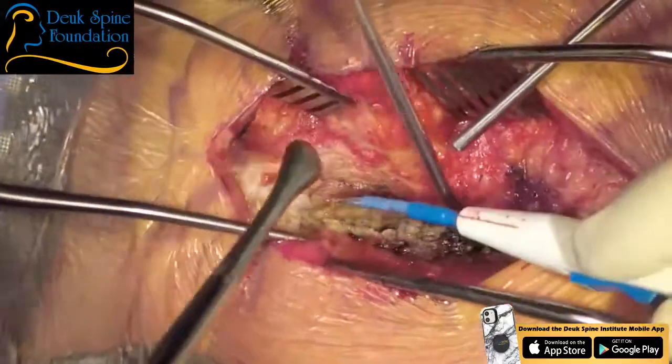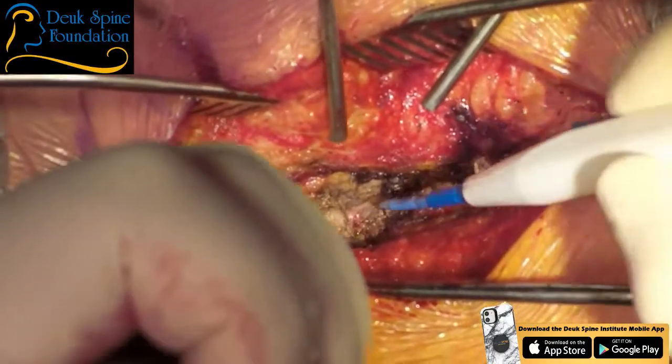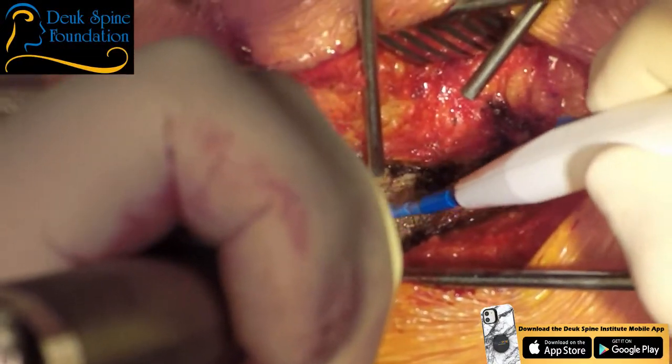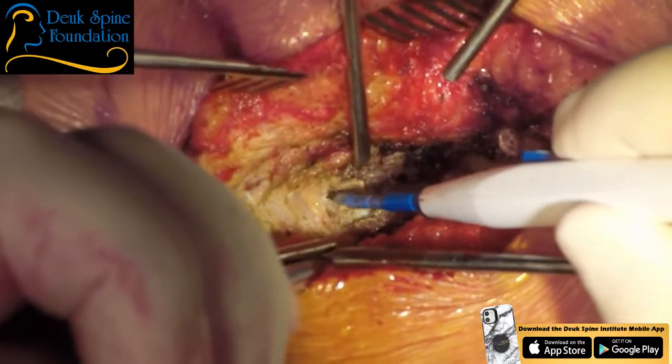Another thing you need to know when you're doing the exposure is you want to be between the muscle bellies. So that's why you want to come down on the tips of the spinous process as well. You don't want to come into the muscles. You want to come in between the muscles. And as long as you come down on the tips of the spinous process, you won't cut the muscles.